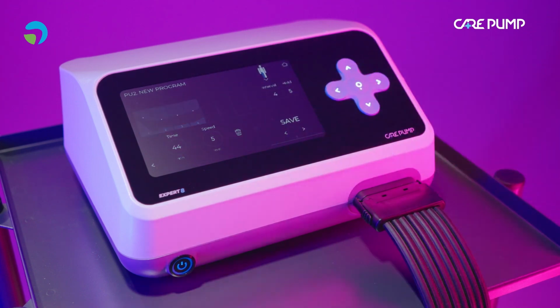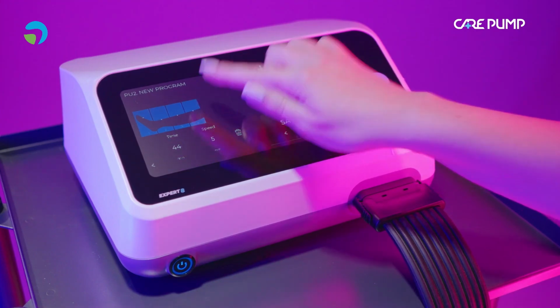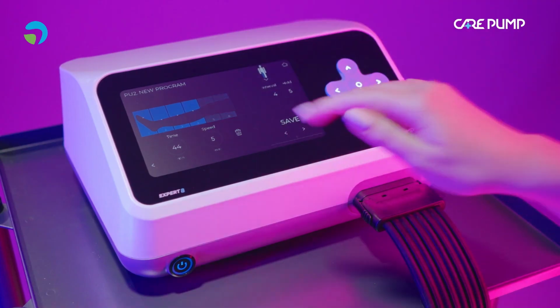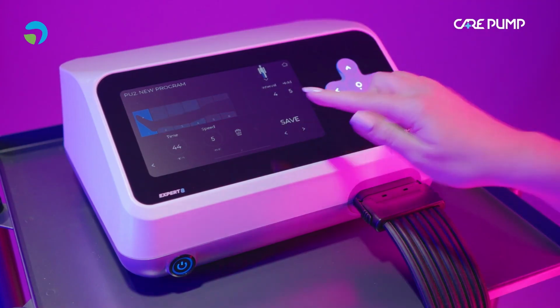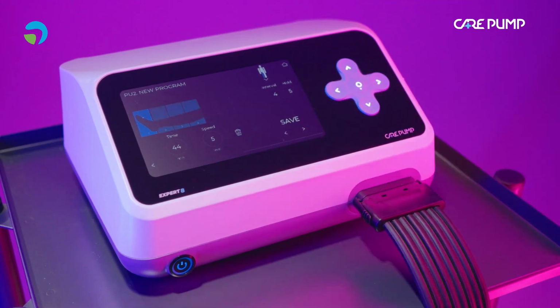Chambers filled with air in the previous sequence will be marked with a white dot. To return to the view of the previous cycle, use the left arrow. You can delete each of the created sequences using trash can icon.